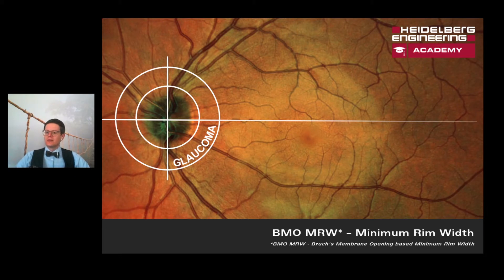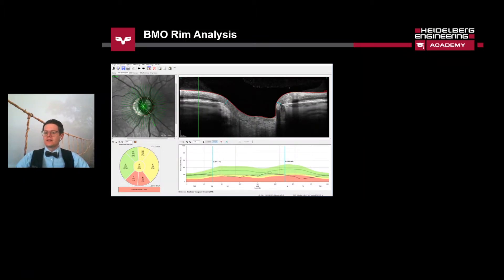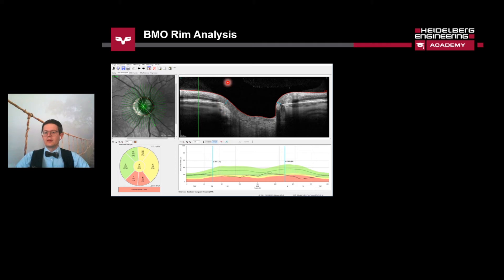Let's start with a closer look at the analysis of the BMO-MRW. In the analysis window we can see the infrared image on the top left and the corresponding OCT to its right. Each of these red points corresponds with the position on the left and right hand side in the OCT scan. The blue arrow shows the minimum rim width measured by the software automatically from the Bruch's membrane opening to the internal limiting membrane. On the bottom left we can see the Garway-Heath sectors that use the mean value of the Bruch's membrane opening minimum rim width.